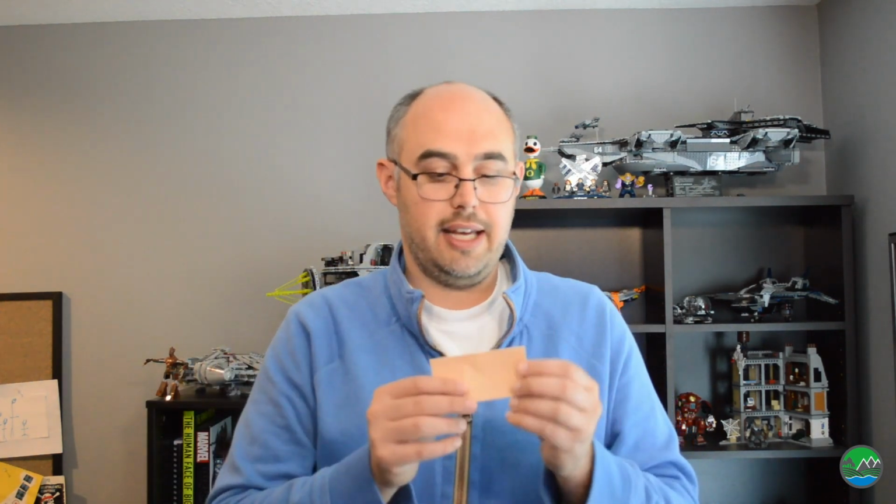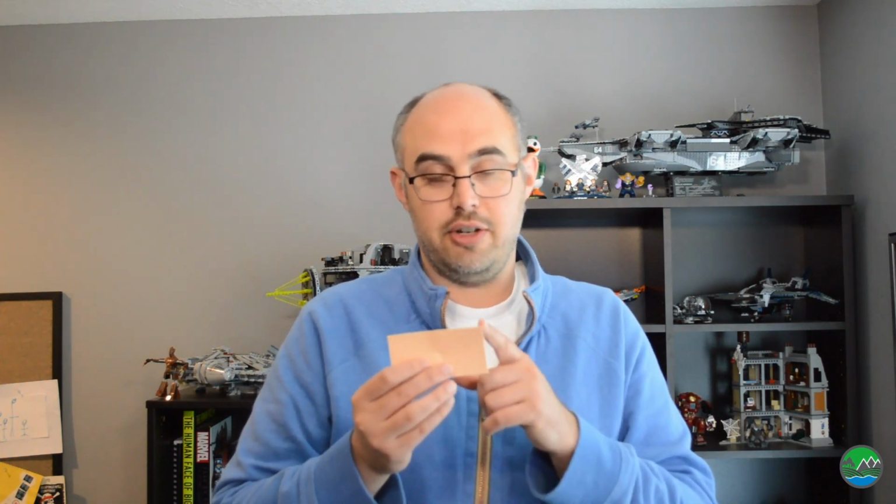Moleskin is a way to help with blisters. Let's say you need to walk and you weren't planning on it, and you're in dress shoes and you now have to walk from your office downtown 3 miles to your home. You likely are going to get blisters on the back of your heel if you don't do that regularly. So Moleskin is great because you can cut it up and put it on the areas that are rubbing against your shoe or gloves or something like that, and it will help to eliminate or limit the blisters that you get.